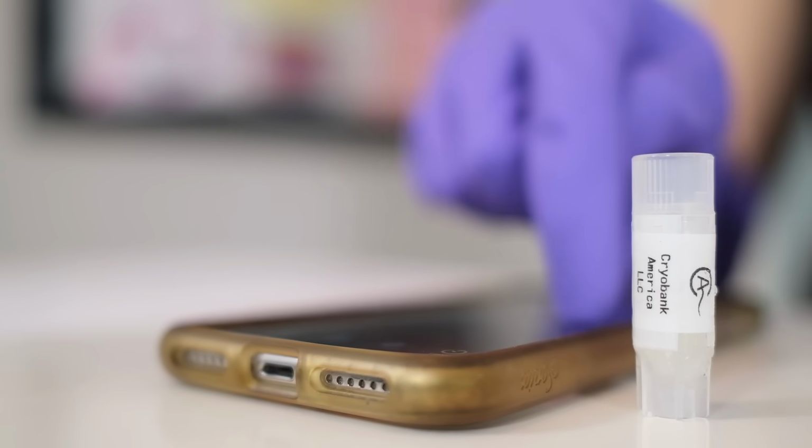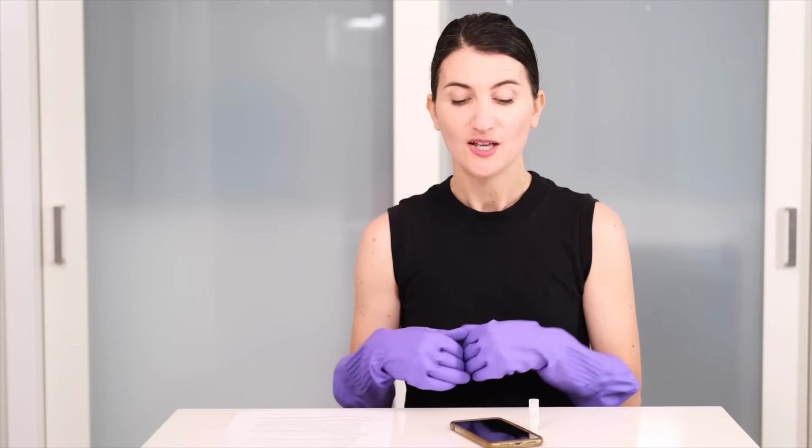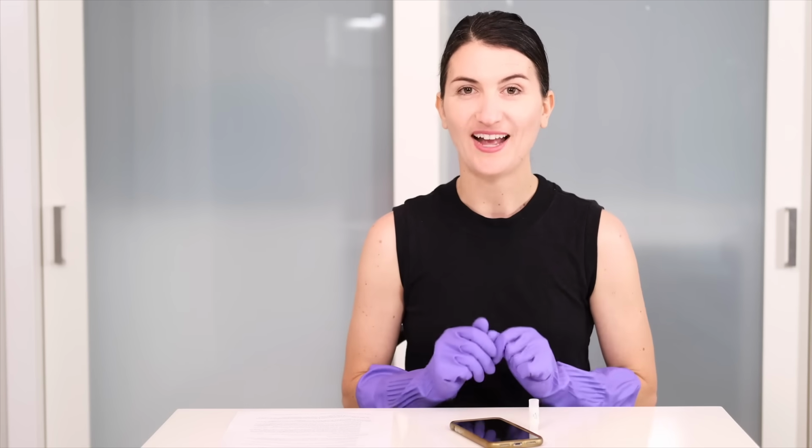This is also a good chance for you to take a moment and prepare your insemination spot. This should be somewhere comfortable like a bed or a couch. You'll want to make sure you have your blankets ready, your pillows ready, your podcasts ready, your TV shows ready, whatever it is that you'll want, because after inseminating, you'll want a little bit of time to lay there, 15 to 30 minutes after you've inseminated. So we will be back when the time is up here and this vial is liquid. See you in a few.